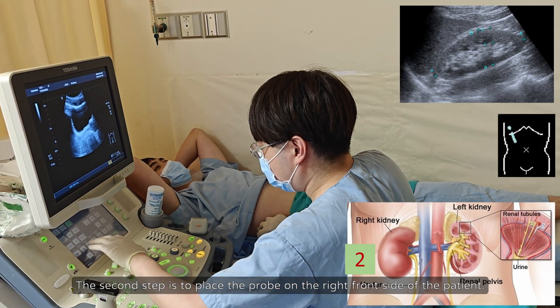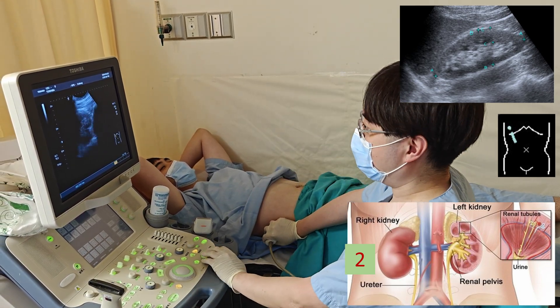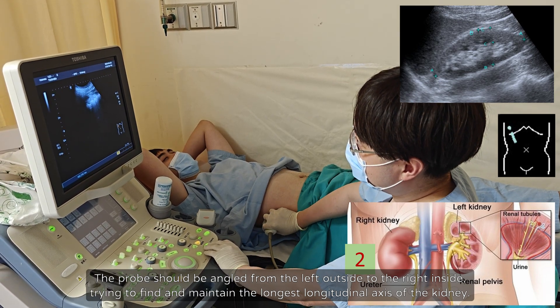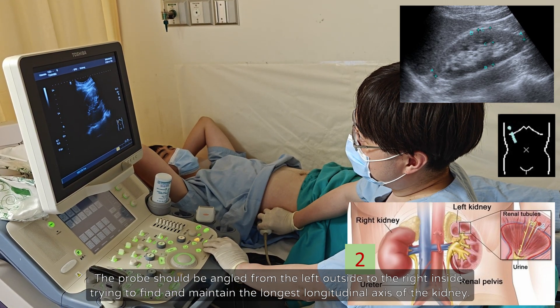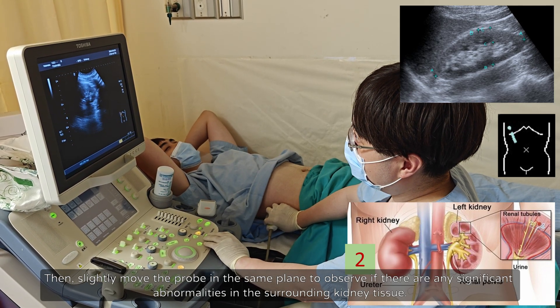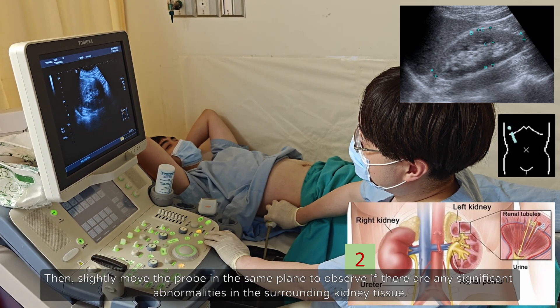The second step is to place the probe on the right front side of the patient. The probe should be angled from the left outside to the right inside, trying to find and maintain the longest longitudinal axis of the kidney. Then slightly move the probe in the same plane to observe if there are any significant abnormalities in the surrounding kidney tissue.